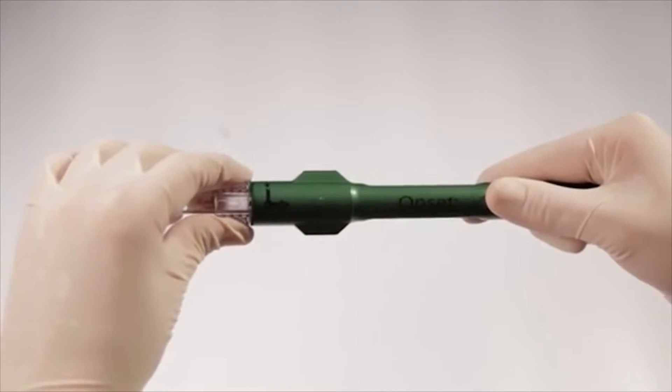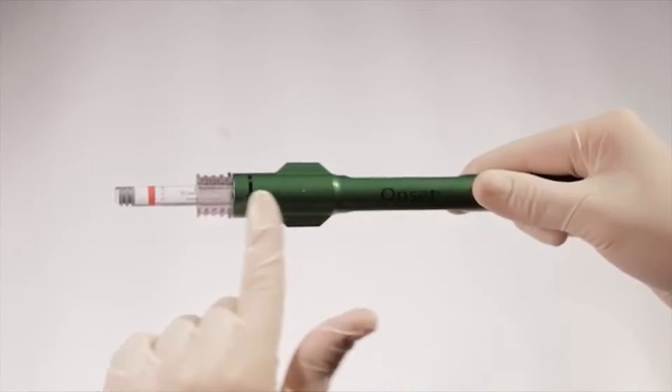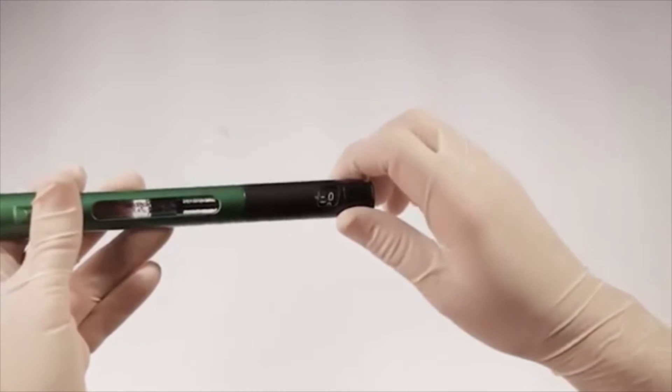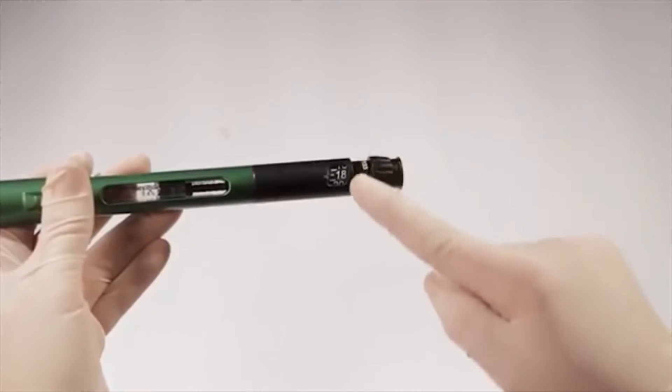This step will lock the 1.8-milliliter cartridge in the connector. Next, push the connector forward to the number three position. In the number three position, you have established a sterile fluid path between the two cartridges. Next, turn the volume dial to the desired amount of solution to be dispensed from the 3-milliliter cartridge to the 1.8-milliliter cartridge.